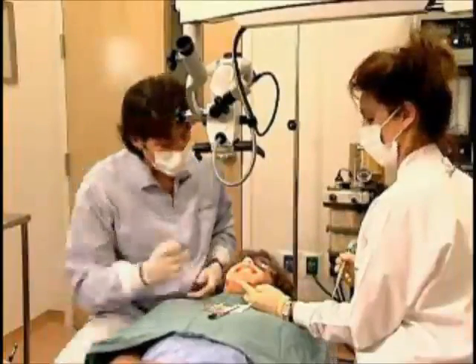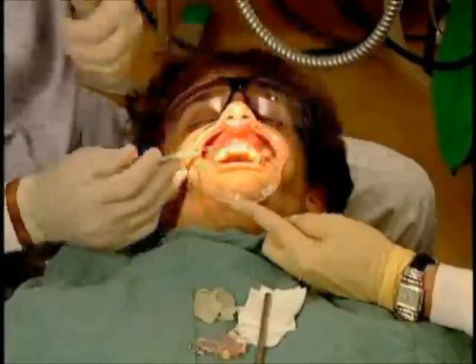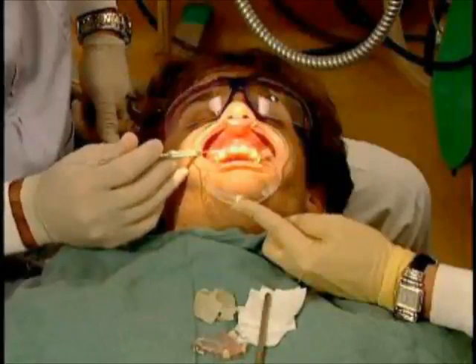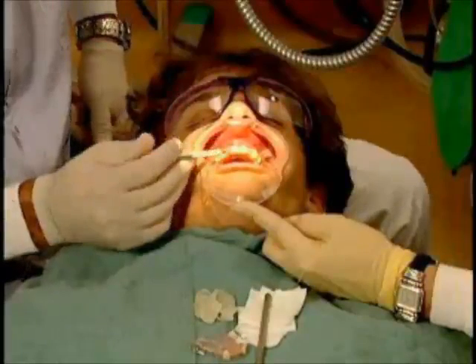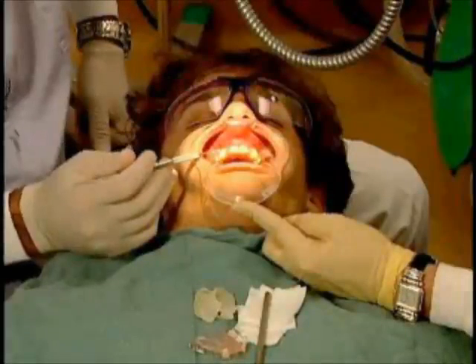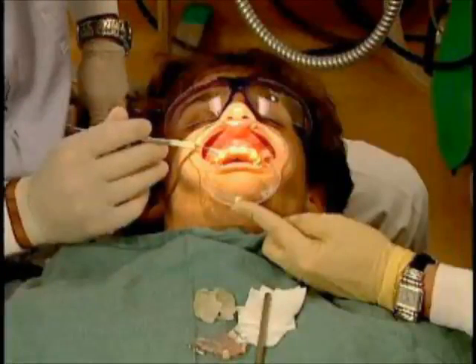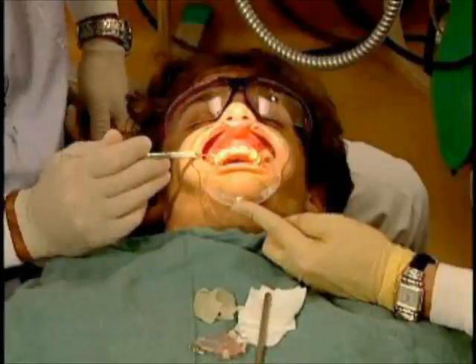Due to the topography of this area, we had some concavities that we saw on the 3D images. Normally what you have in these areas is a little bit of deficiency in the bone due to the fact that the permanent teeth never formed. These concavities are down in the middle of the alveolar process. So we're going to try to place our implants slightly to the lingual with an appropriate angulation.